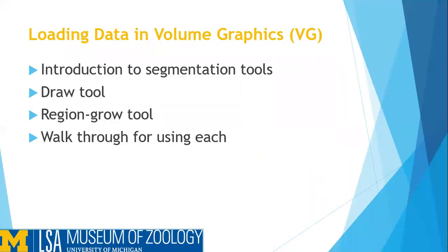Today in this video, I'm going to introduce you to some of the segmentation tools. We're going to talk specifically about the draw tool and the region growing tool. Essentially, this is going to be a walkthrough for each of the two tools.